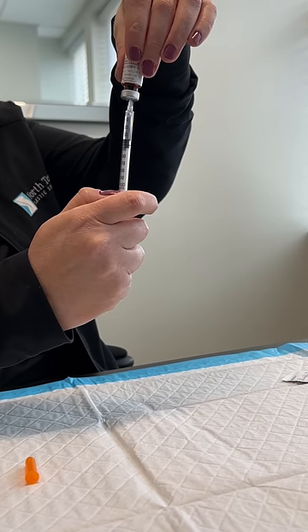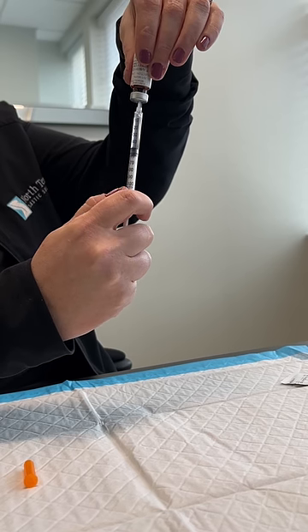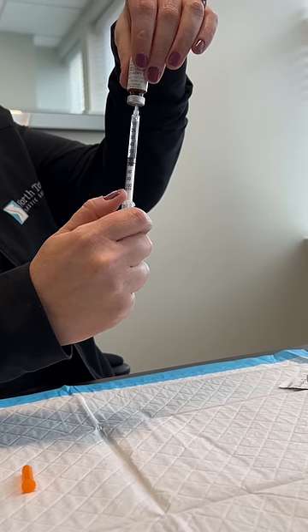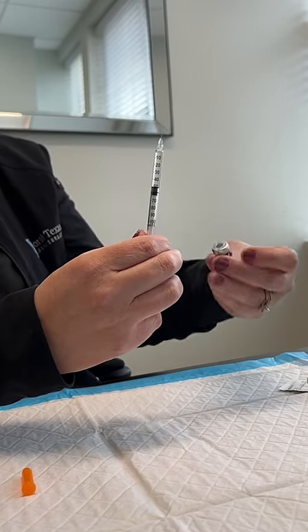Please remember with this, you are only getting a small amount of this medication to begin with. These are very small doses, so don't panic when the vial looks like it hardly has any medication in it — that is the appropriate dose. Try not to waste any of this medication. You don't get a lot of extra, so be very careful to give yourself that correct amount and don't waste any medication.